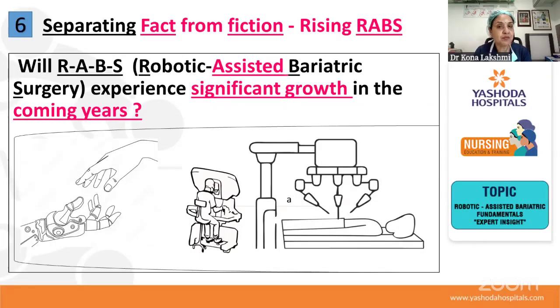These are the problems we were facing, and we fought and fought and tried to do things. The instrument makers, the companies who put research into making instruments, tried to give us a more sturdy structure which can actually handle the complexities, handle the patient's obesity, give us more vision, and let us navigate the narrow parts of the human body where too much instrumentation or visualization was becoming difficult.